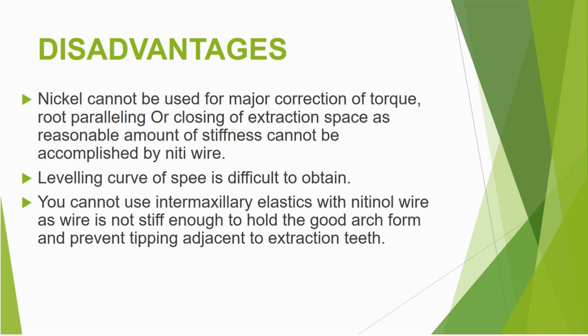Disadvantages of nitinol wire. Nitinol cannot be used for major correction of torque, root paralleling or closing of extraction spaces, as a reasonable amount of stiffness cannot be accomplished by nitinol wire. Leveling the curve of Spee is difficult to obtain. You cannot use intermaxillary elastics with nitinol wire as the wire is not stiff enough to hold a good arch form and prevent tipping adjacent to the extracted teeth.